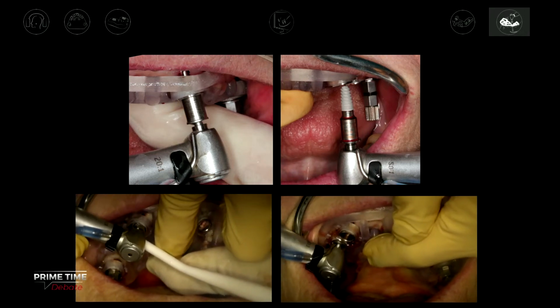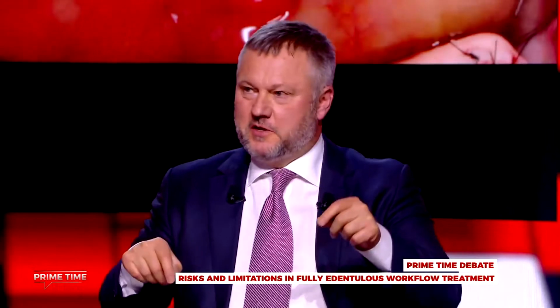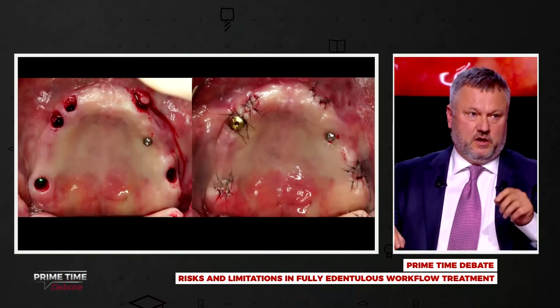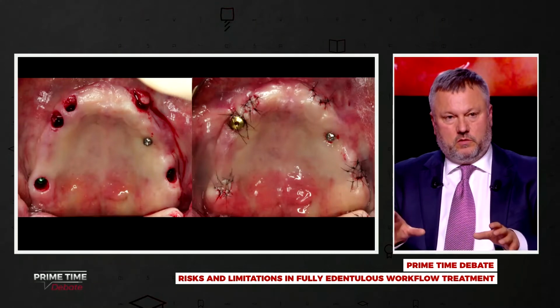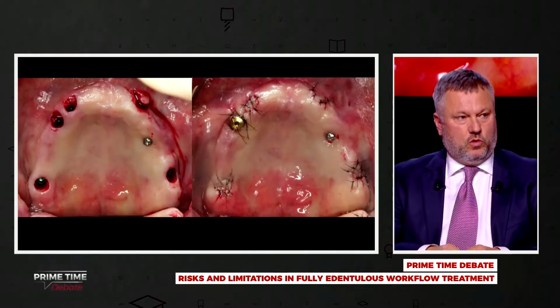Absolutely. So it's a little bit like going back to the old days when we were placing the old Brånemark bridges. You were supposed to tighten them in a certain sequence: start here, then you go here, and then you go here. So here now you place the implant in a certain sequence so that you get your guide always more and more stable for the next one. Exactly, to reduce the deviation as much as possible.